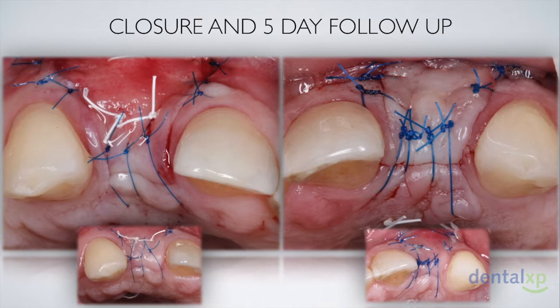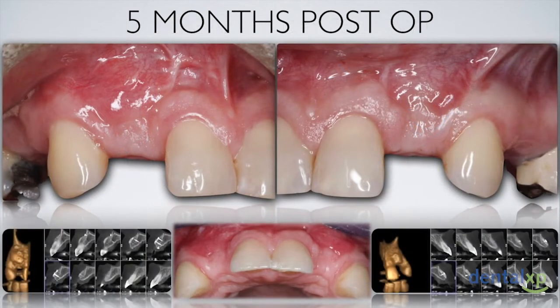And you could appreciate the result of using those micro sutures or 6-0 sutures in a GBR case. It really has an influence on the early healing of the site and maintenance of that primary closure. And this is the 5 months post-op for the case, with primary closure maintained for both sites and good buccal bone volume evident in both of the CT scans.